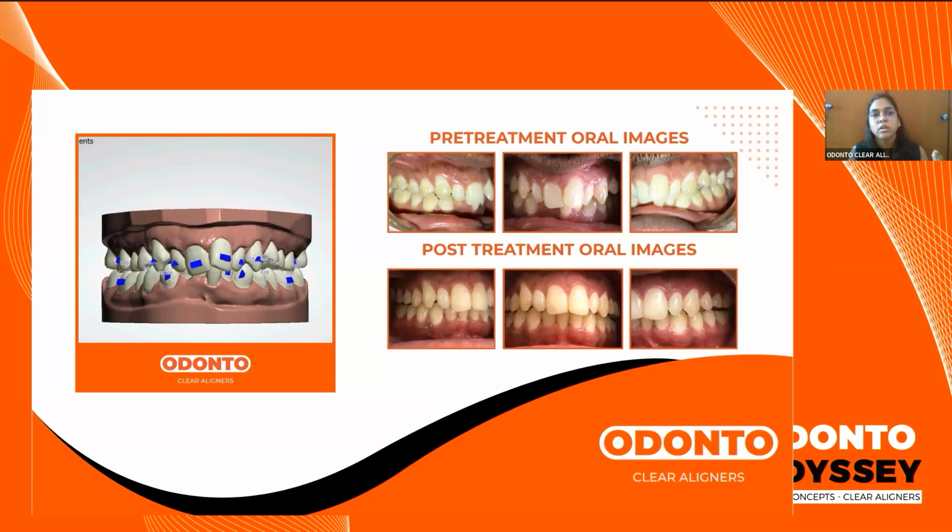If we try to rush ourselves into moving the posterior teeth as well as the anterior teeth together, what happens is that there is no anchorage, there is no good firm support that we receive. And in such a case, your aligner is not going to fit the patient. There can be bowing that takes place, or there can be teeth which do not track, in terms that one tooth gets left behind and the rest of the teeth are falling in place, which is why again you will have to pause the treatment and you will have to restart in terms of taking a new scan and sending a fresh model for it.